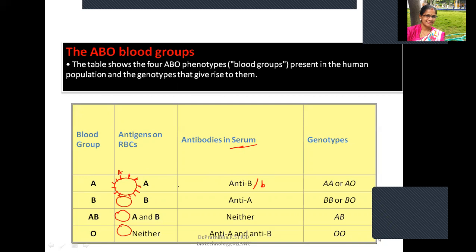So this you can understand through Karl Landsteiner's rule. You have understood; I have explained this particular concept in blood typing. Please have a look at Karl Landsteiner's rule. In viva, the examiners may ask that question, so please go through what Landsteiner's rule is. Anti-B, and what kind of genotype can be seen in that particular person? We can see homozygous AA or heterozygous. That is the genotype.